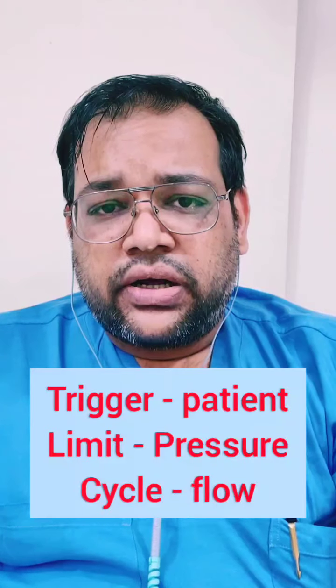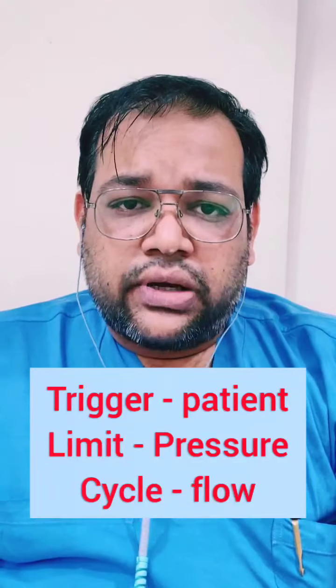Technically, if you say trigger, limit and cycle, it is a patient triggered, pressure limited and flow cycled mode. So each breath is triggered by the patient. The machine is not triggering the breath here, and you can set the trigger as pressure or flow based on the options in your ventilator. If the patient makes that much effort to reach the trigger, the ventilator will give a breath. It is limited by pressure, so whatever set pressure above PEEP you have kept in the ventilator, that much pressure will be maintained throughout the inspiration.